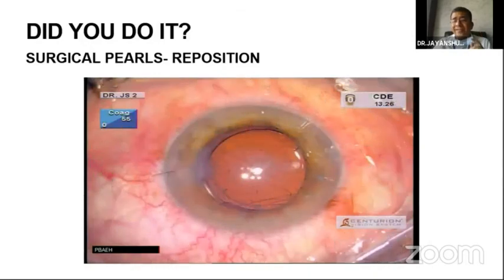And now if you can see, this is a split which has taken place. A detachment has torn in a V, and in these situations also it is very important to unfurl from both sides and replace the air or the C3F8 from either side.